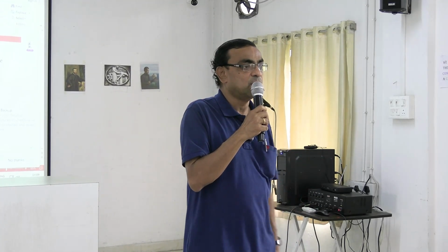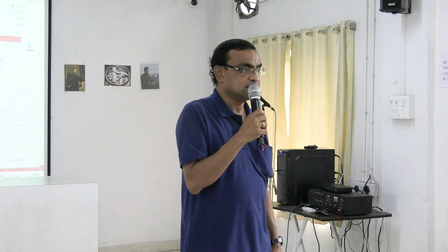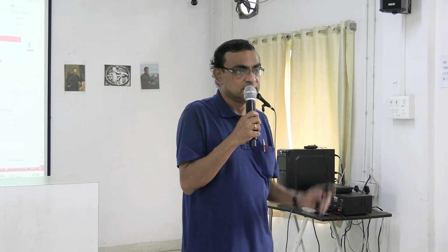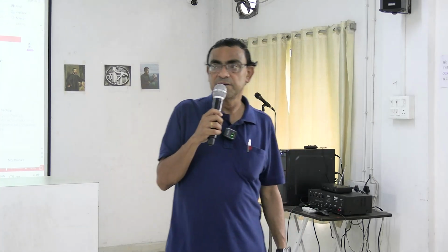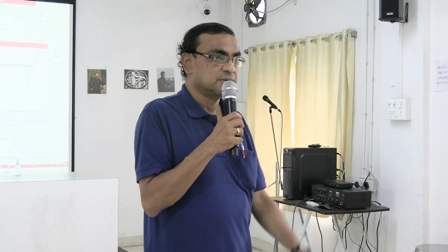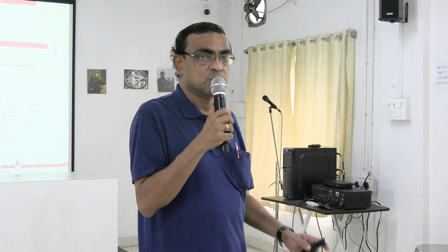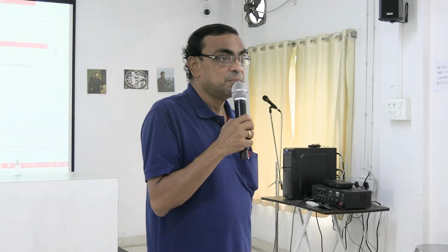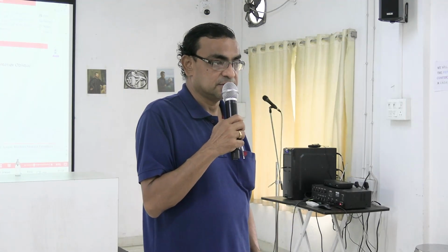At your level, only the plain X-rays of the head and neck region are very important, and for your examination, just remember that those are plain radiological X-rays.